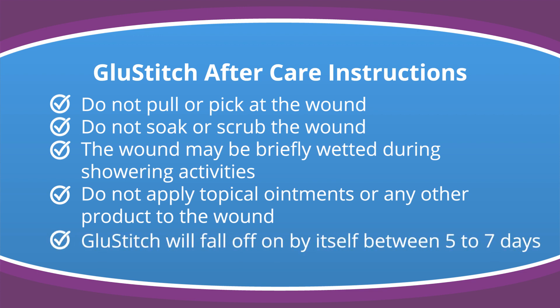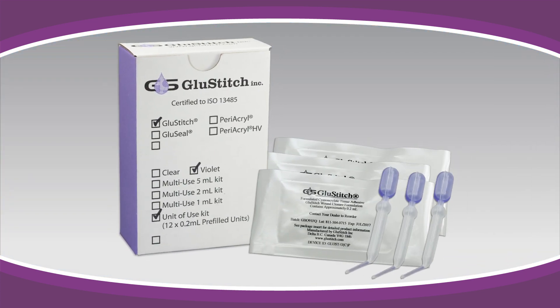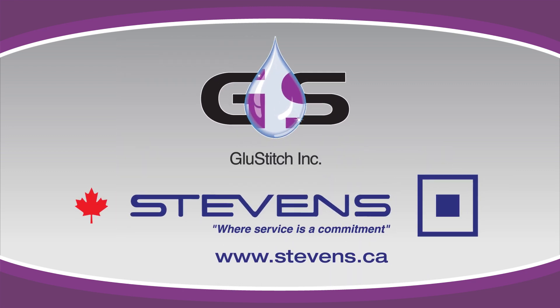Glue Stitch will fall off by itself between 5 to 7 days. Glue Stitch single-use is affordably priced and can be purchased by the box or by the individual pipette from the Stevens Company.